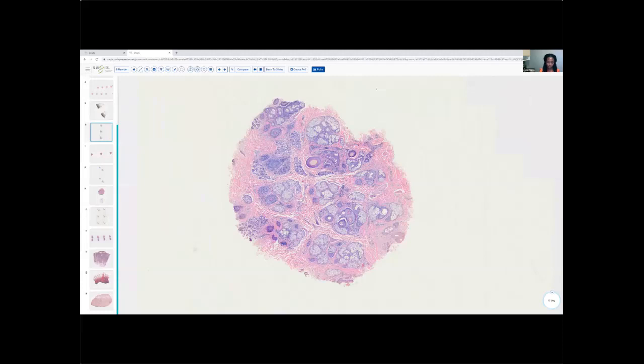We're going to figure out where we are, what level of the skin are we looking at. And we see those nice full sebaceous glands. Maybe there's an arrector pili muscle or two. So we know that we're at the level of the isthmus. So we've got that sorted out. And globally, can we appreciate that there's some hair loss? And certainly there is, areas where we just see that there should be a follicular unit and there isn't.